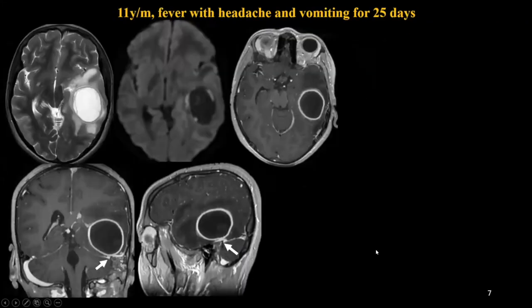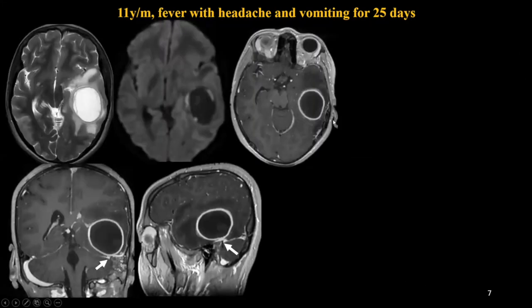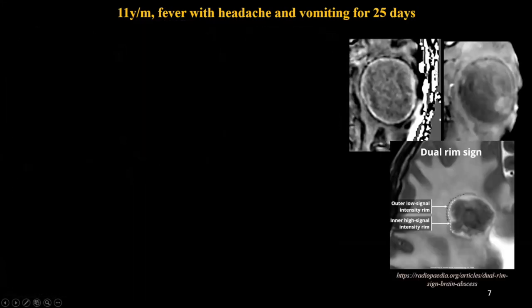This 11-year-old boy had fever, headache, and vomiting for 25 days. On basic imaging, you see a T2 hyperintense cystic lesion with multiple internal septae, showing wall diffusion restriction — patchy — and on post-contrast there is a well-defined thin wall enhancement. The abscess is not showing complete diffusion restriction, but on close attention the dura in contact with the temporal bone is thickened and showing enhancement. The patient had the classical dual rim sign on SWI: an inner hyperintensity representing granulation tissue and an outer hypointense rim representing the fibro-collagenous membrane of the abscess — classical of a pyogenic abscess.